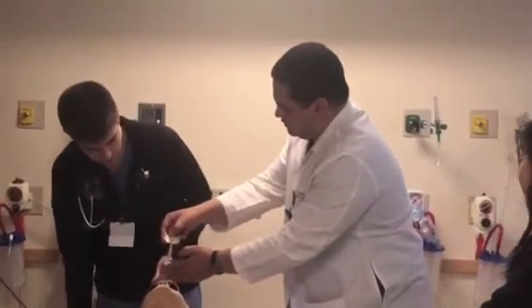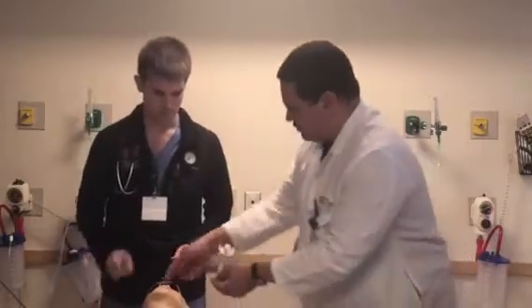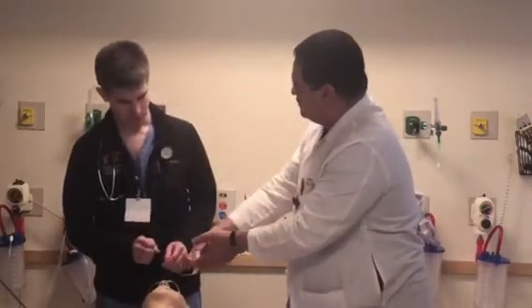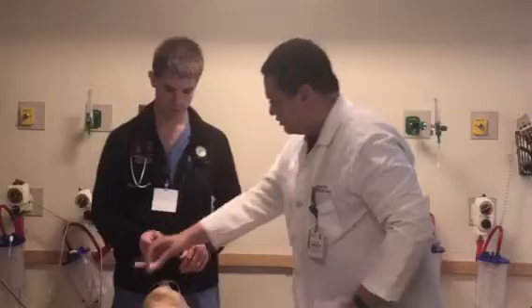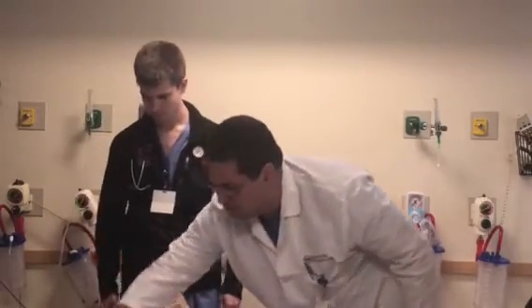The skin will be here like this, and this then is here. Advance it. And then you have a scalpel here. You cut and advance. So that's easy. Let's tuck these away before somebody punctures themselves. Okay, so that's that.